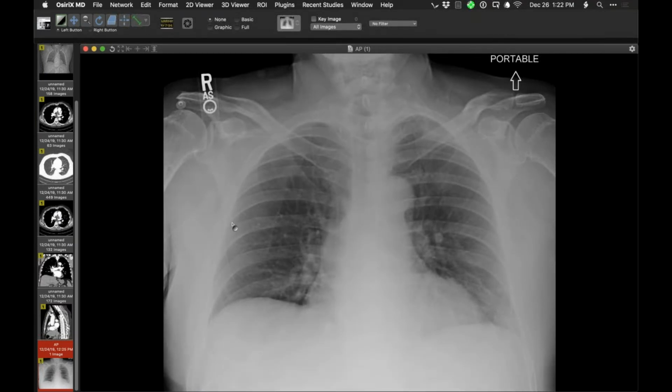Yeah, it just shot back up there, didn't it? I guess it just flowed with the blood back down. Yeah, because I think I've shown one, and I remember Jeff making the same comment before. Yeah, it's like letting go of a fire hose. It's got water flowing through it.